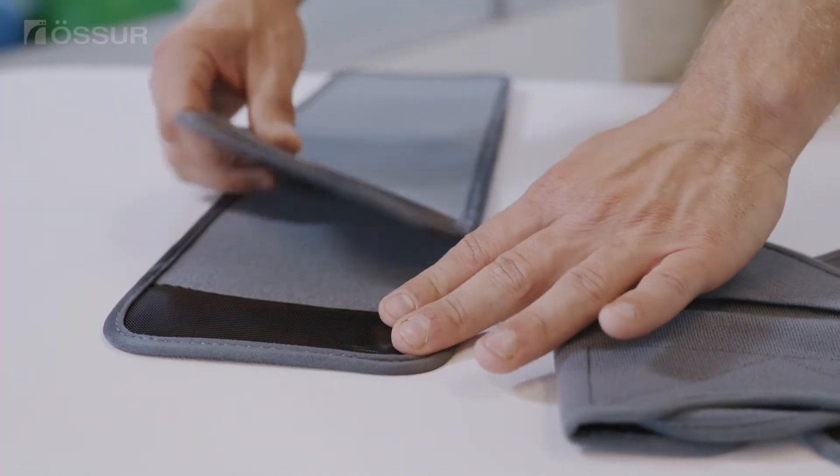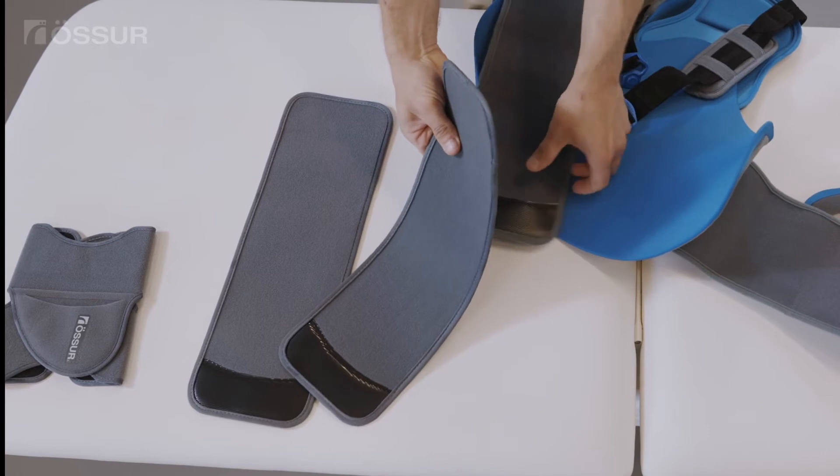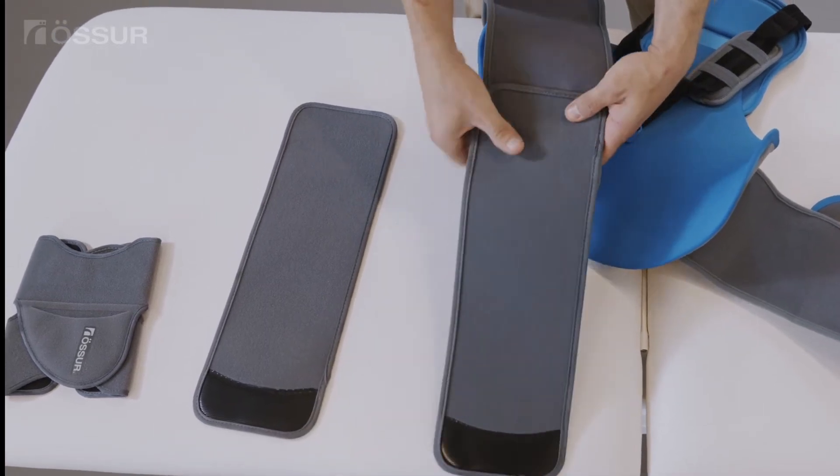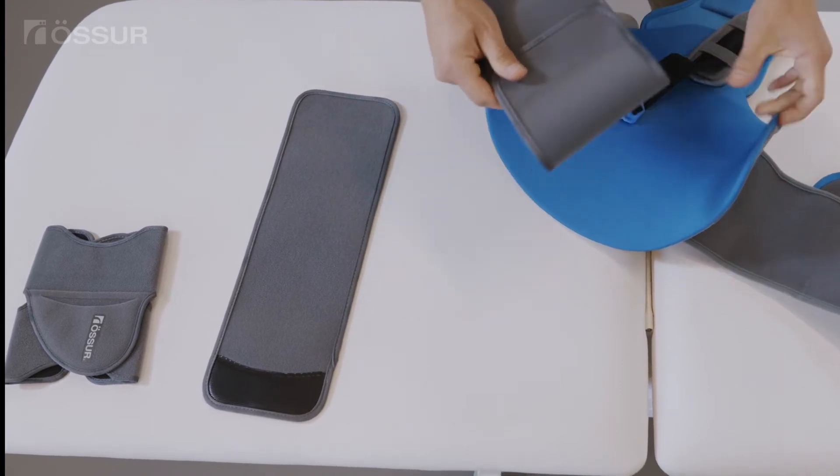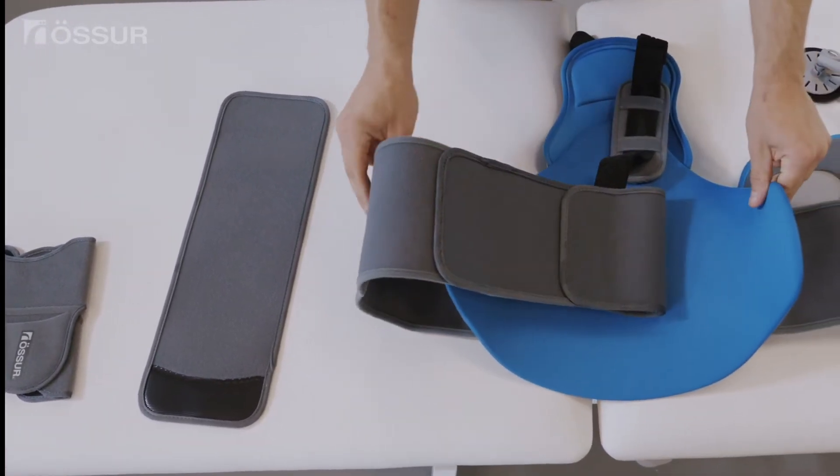If the patient's waist exceeds 50 inches or 127 centimeters, an extension belt can be added to each belt arm to reach a maximum belt circumference of 70 inches or 178 centimeters.